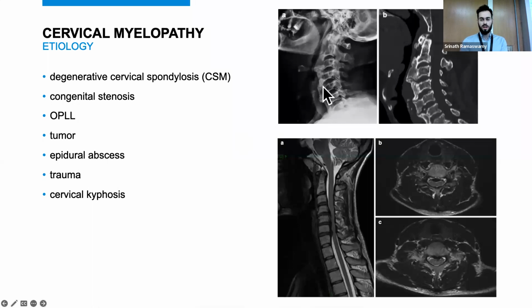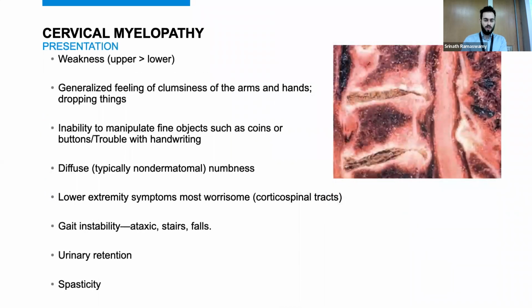A lot of times you see something like this: diffuse idiopathic skeletal hyperostosis or ankylosing spondylitis, or a lot of calcification. Sometimes the body actually fuses some of those levels, and if there is no compression there, that's fine, but most of the time there is. And then sometimes you see ossification of the posterior longitudinal ligament. You can see here this black thing behind the body on the MRI. You can only see bone on a CT scan, but you can see a very dark shadow, and that suggests a longitudinal ligament being ossified, which is important to know if we're going in from the front.